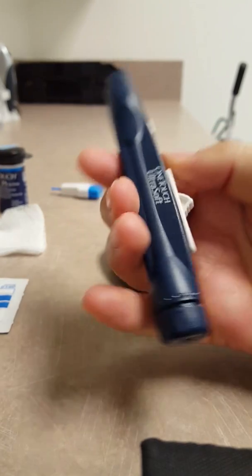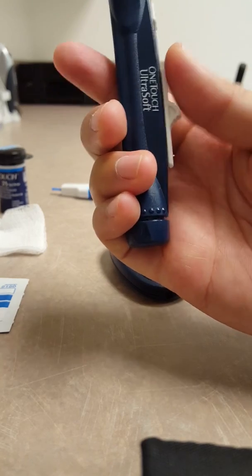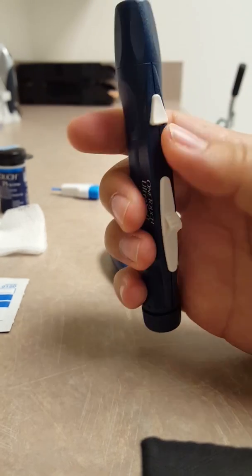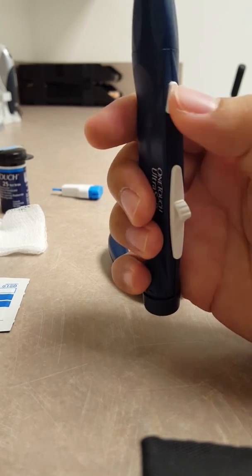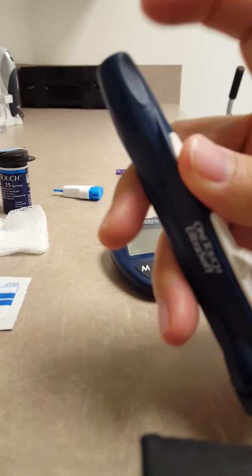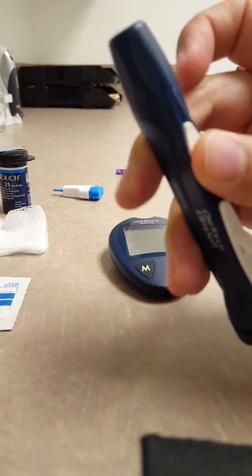So this lancet device has a sliding handle that you'll pull back. This will set the spring, and then the button is what is going to set the spring off, and then the needle which we're going to insert here is going to prick your finger through the top.